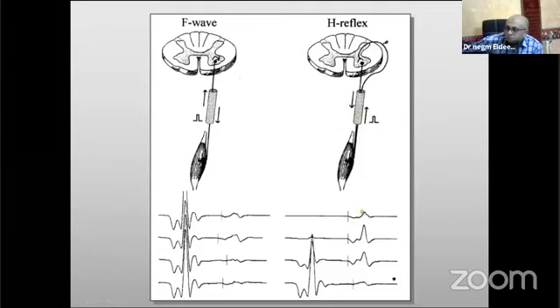And by stimulating very carefully, we are able to stimulate just the sensory, and therefore we just get this response. We increase the stimulus a little, we see it higher amplitude. And then when we increase the stimulus even more, we also start to stimulate the motor nerves in both directions. And this motor nerve that goes in the antidromic direction will meet the signal that started here and came out as a motor. It will be collision right here.